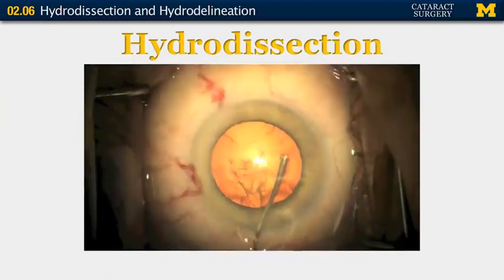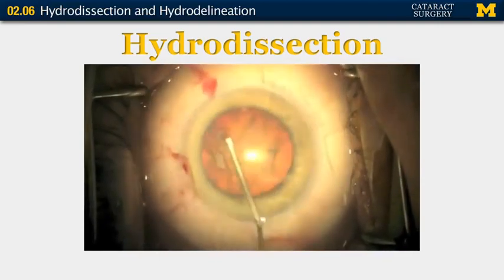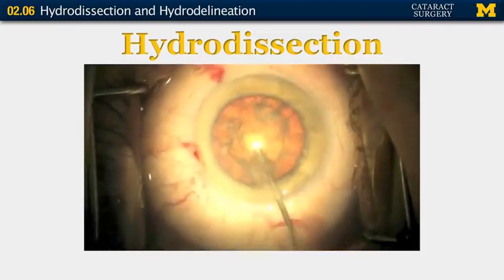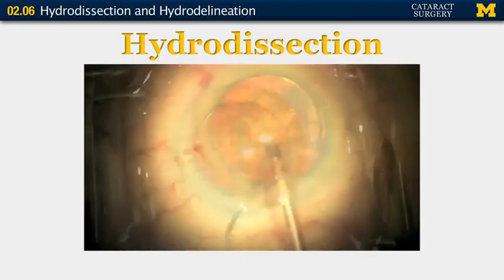The cannula is placed across the chamber and beneath the capsule, kept lifted slightly, and fluid is injected. Here are two sites — you can see the wave passing behind the lens. The nucleus is then pushed posteriorly slightly to allow fluid to pass forward. The nucleus is then spun, as you can see.